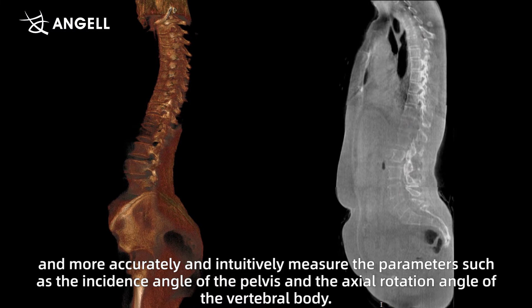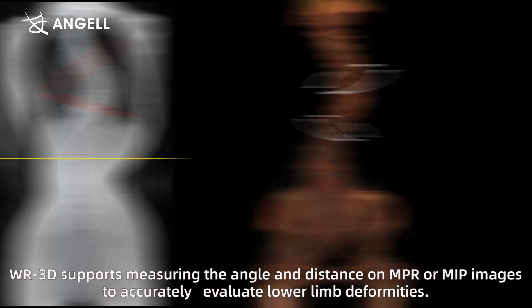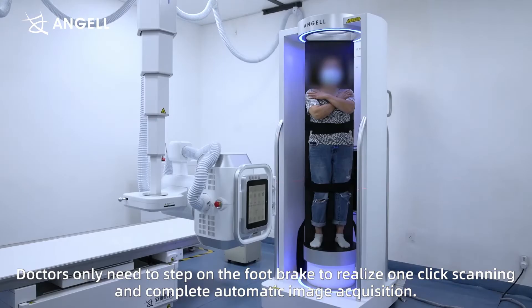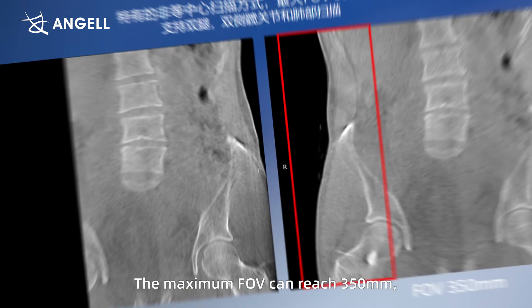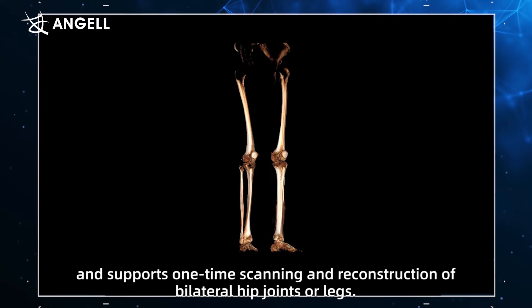WR3D supports measuring the angle and distance on MPR or MIP images to accurately evaluate lower limb deformities. Doctors only need to step on the footbrake to realize one-click scanning and complete automatic image acquisition. The maximum FOV can reach 350mm, and it supports one-time scanning and reconstruction of bilateral hip joints or legs, effectively assisting doctors in preoperative planning and postoperative evaluation.